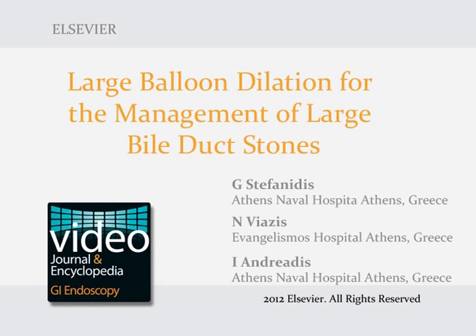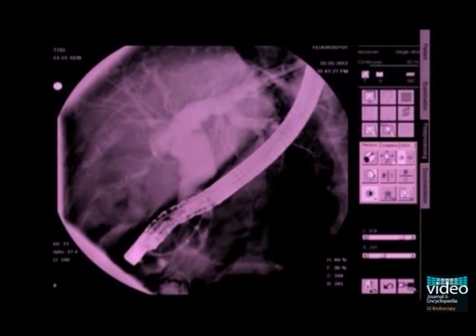A radiology image showing the occlusion cholangiogram performed after the stent removal. The dilated common bile duct with the filling defects can be seen.